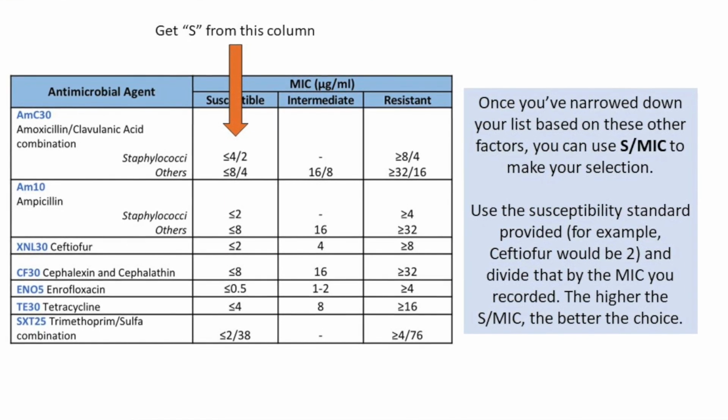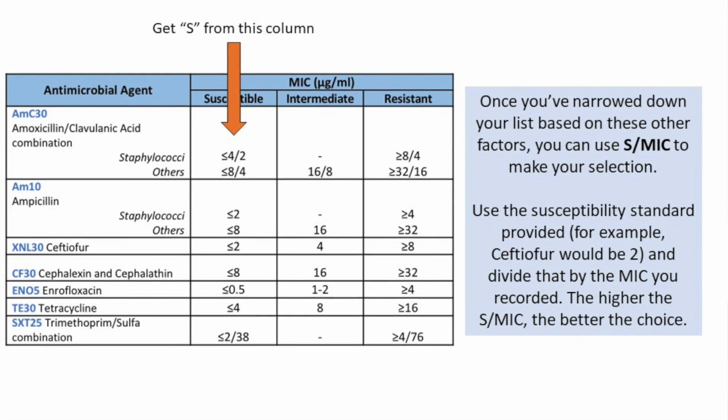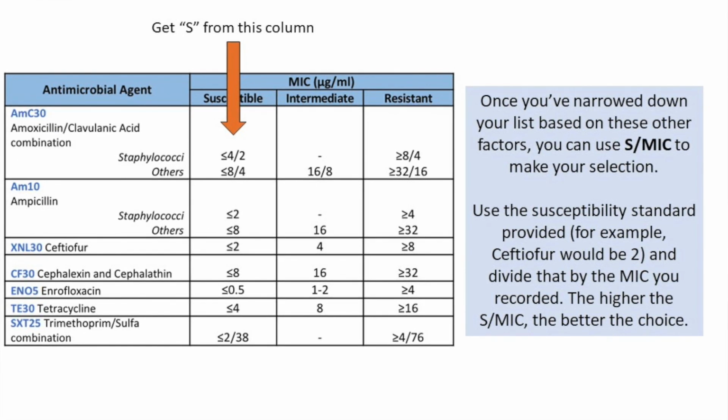And so that can be one last step for you that can help you in deciding which antimicrobial you are actually going to choose.